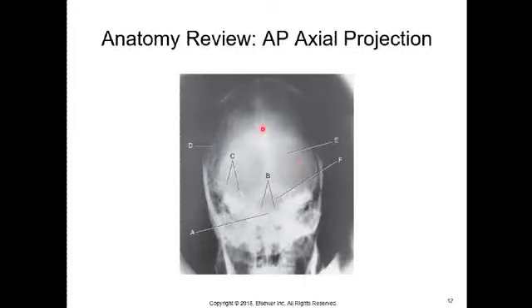E is pointing, this section here is actually your occipital bone. So I don't know if you could see, but can you see the suture line here? That's a suture line, that's a suture line, and then there's a line going this way. This is your occipital bone, and this is your lambdoidal suture here. So that's what you're looking at. I know it's kind of funky looking. This is the alien shot, I like to call it, but that's what it looks like.